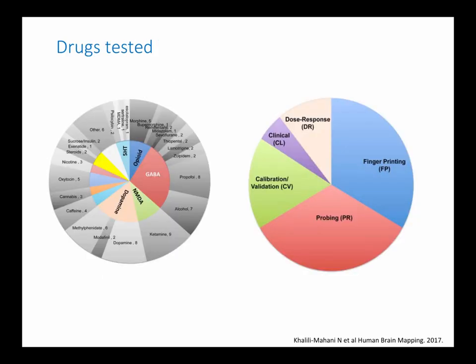So all of this is basically just to say that you can do this. This is not an exhaustive list of examples. I would refer you to this paper, which is a pretty good summary of a lot of the resting state types of experiments that have been done. You can see that a lot of different drugs have been tried over a bunch of different CNS modulating things, in terms of looking at different receptors and for different reasons as well.